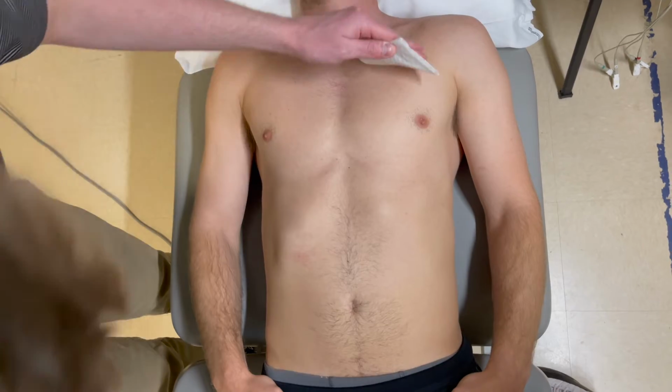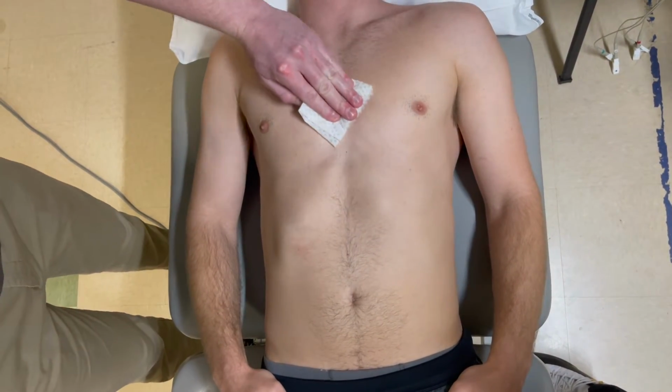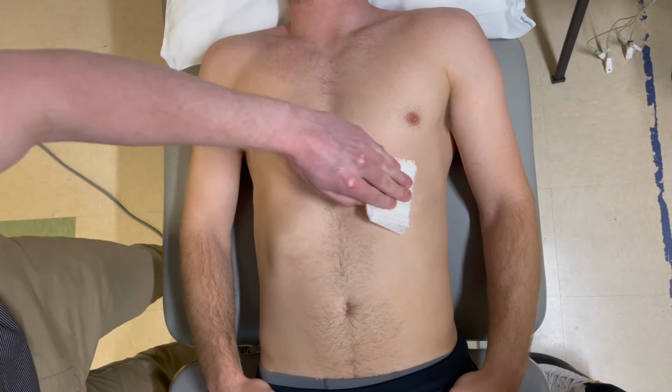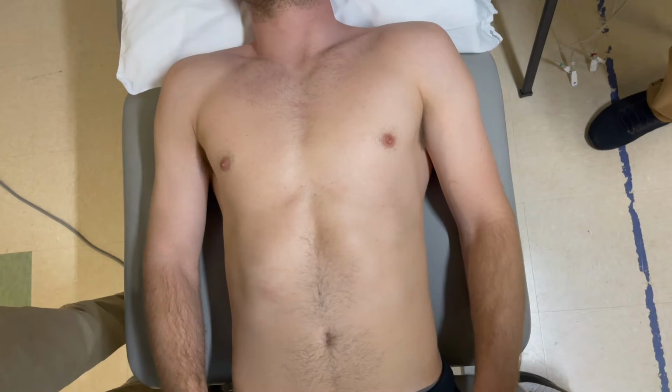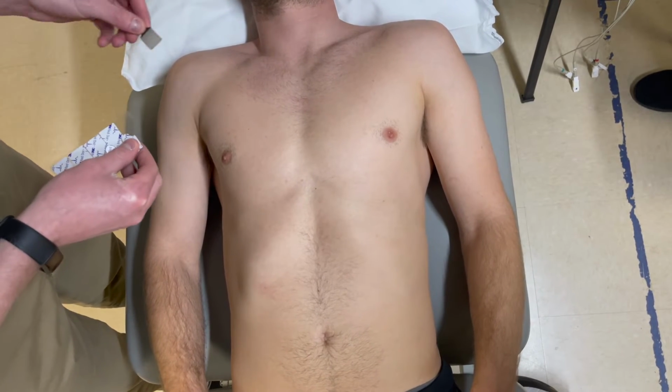Okay, first we will start with cleaning the body with alcohol swabs to ensure the body is clean and the electrodes will stick properly. Next, we will do the first 4 electrodes. 2 will go on the arms and 2 will go on the legs.